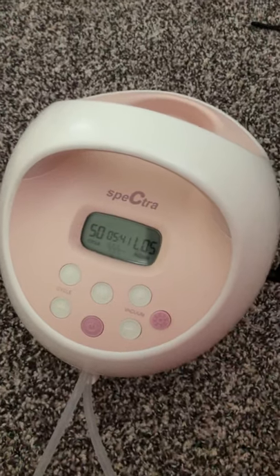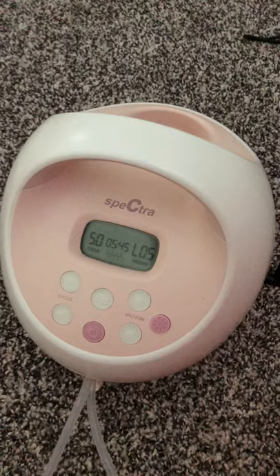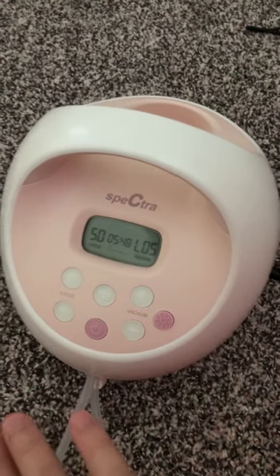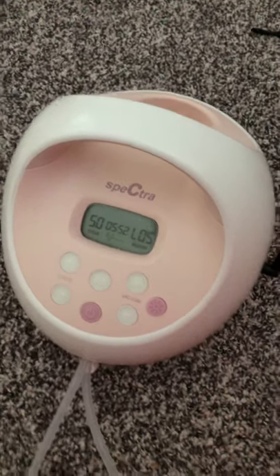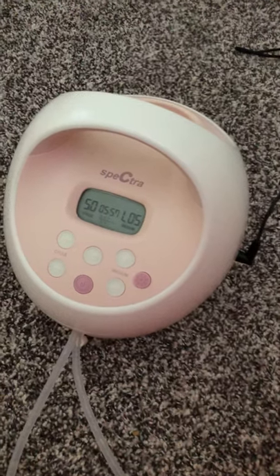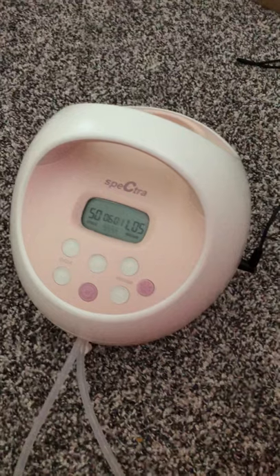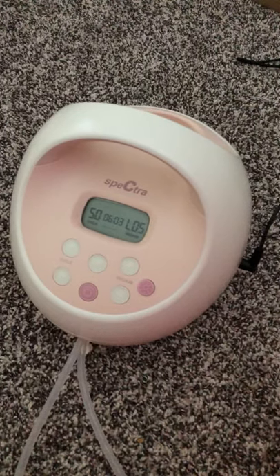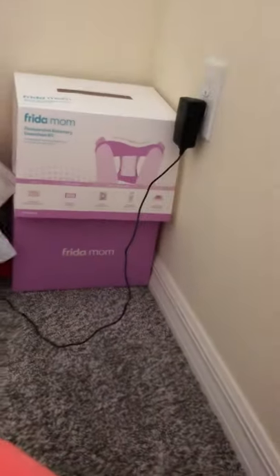It has a little cup holder back here where you can put one of the bottles when you're done. Now I have the double electric breast pump and this is the Spectra S2 — it's the pink one. You can get the Spectra S1 as well, and the only difference is that the Spectra S1 is a little more expensive and it has a built-in battery of three hours if it's charged, and it also does plug in.